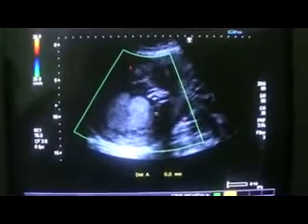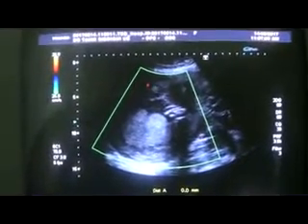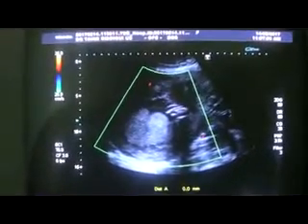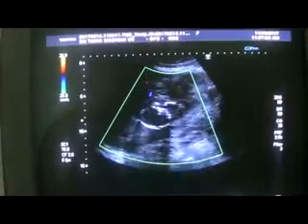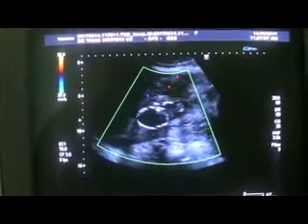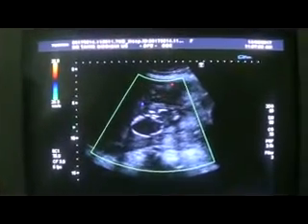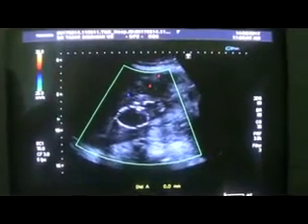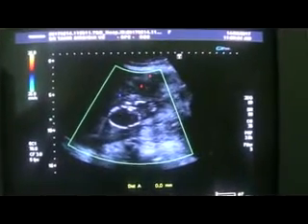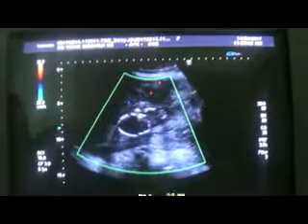This is the placenta. This area is placenta. This is the fetus — these are the fetal parts, and this is the head of the fetus. Showing overlapping of the skull bones — this is Spalding's sign.